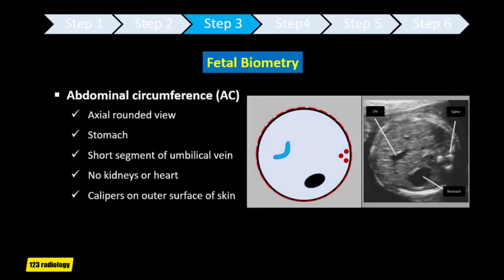The abdominal circumference is measured on axial view through the upper part of the abdomen. It must be rounded, with the stomach and a short segment of the umbilical vein visible. There should be no kidney or heart visible, and the calipers should be placed on the skin line. Abdominal circumference is used with other biometric parameters to estimate fetal weight and may allow detection of intrauterine growth restriction or macrosomia.